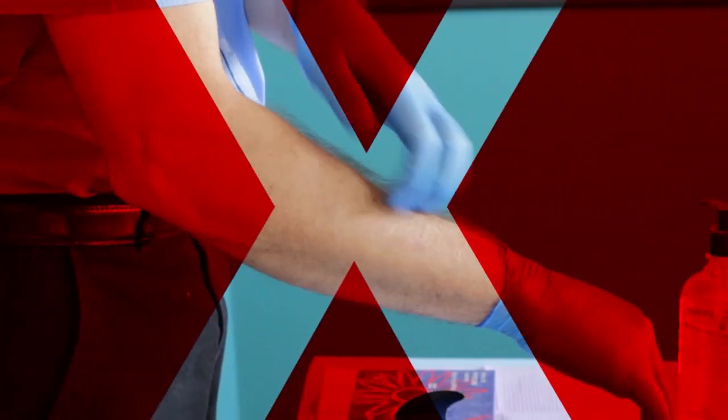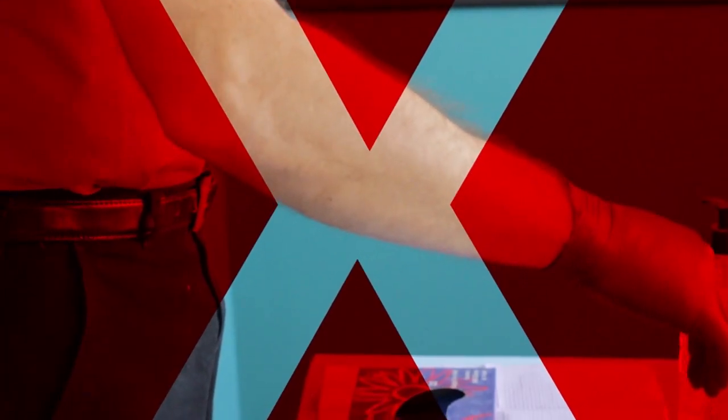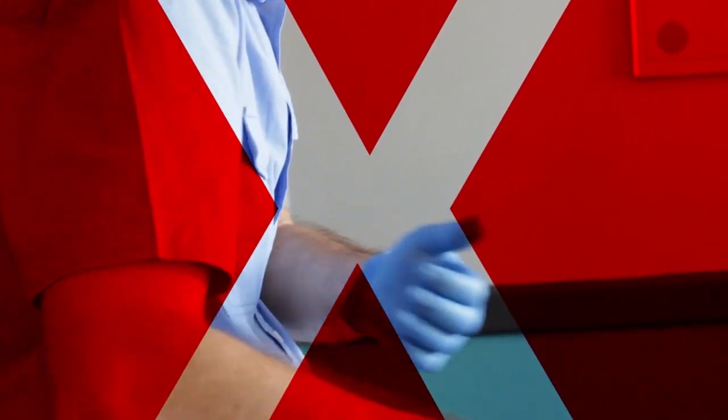With gloved hands, the healthcare worker should not touch anything that is not indicated for glove use. Proceed with performing the intended procedure, such as examining a patient or drawing venous blood.